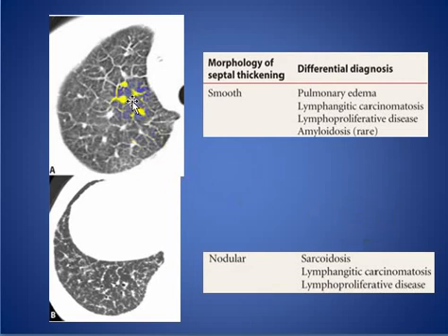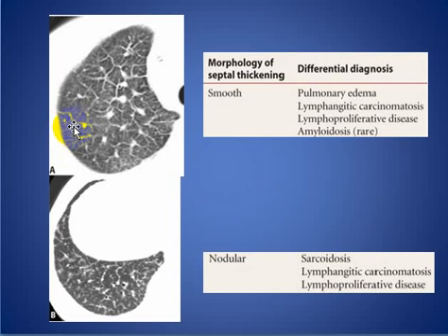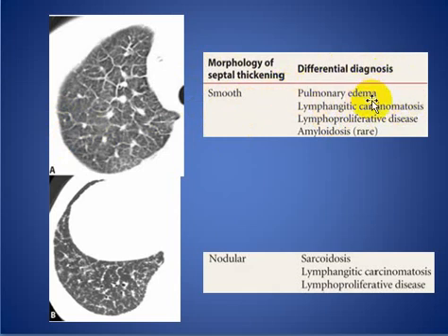If the interlobular septal thickening is smooth — as in this case, where we see thickening of the interlobular septum with the central pulmonary arteriole represented as a dot — there are two main causes: the first and most common cause is pulmonary edema, and the second most common cause is lymphangitis carcinomatosis.